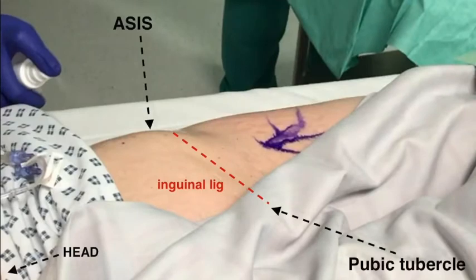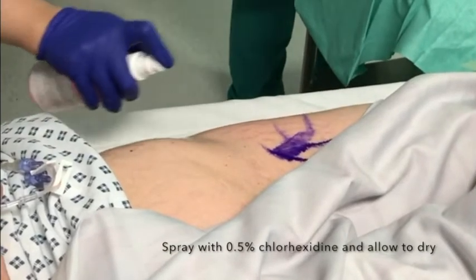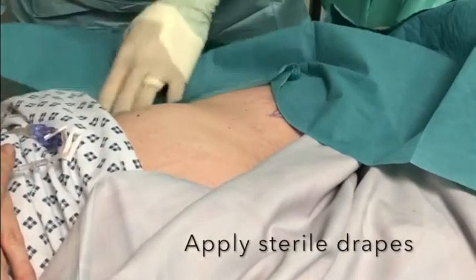Expose your patient's hip and groin area and spray the area with 0.5% chlorhexidine as shown here and allow this to dry. Use sterile sticky drapes to prepare the hip area. You will need access to the lower abdomen so avoid draping too low.